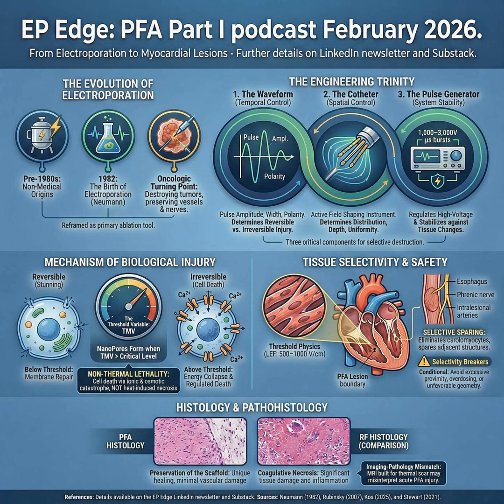Now, where did this all come from? Electroporation wasn't invented for cardiology. It started as a biophysical phenomenon. Before it was medicine, it was industrial science. In food processing, pulsed electric fields were used for non-thermal pasteurization. Think milk, juices, where you want microbial inactivation without cooking the product. In biotech and genetic engineering, electroporation became the workhorse technique for getting DNA or other macromolecules into cells. You apply short, high-intensity pulses, the membrane becomes transiently permeable, and you get uptake.